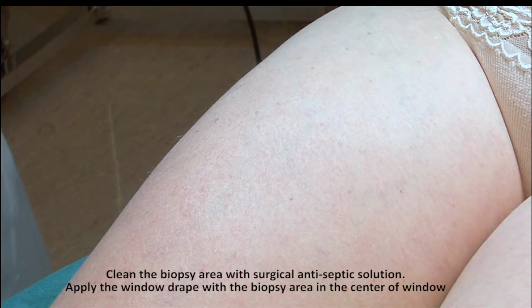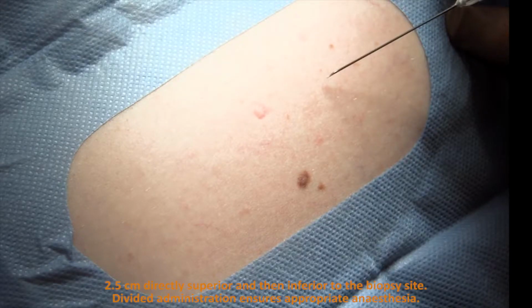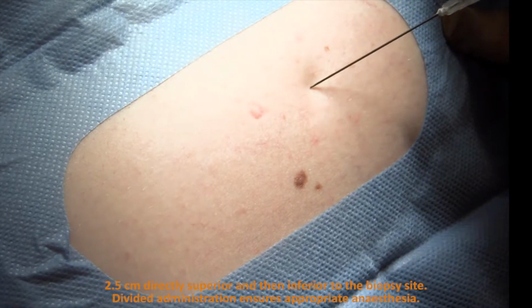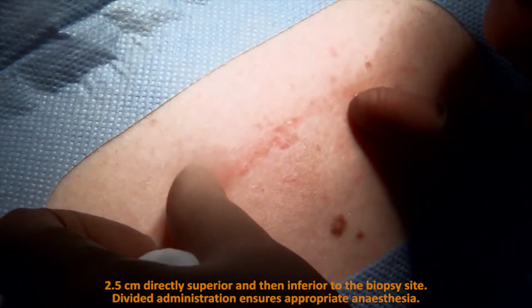Clean the biopsy area with surgical antiseptic solution. Apply the window drape with the biopsy area in the center of the window. Lidocaine or xylocaine is administered from 2 approaches, 2.5 centimeters directly superior and then inferior to the biopsy site. Divided administration ensures appropriate anesthesia.